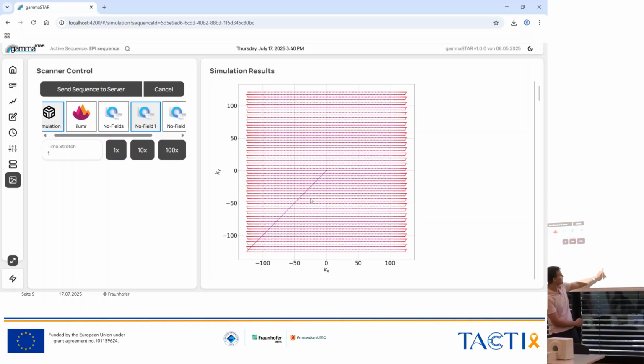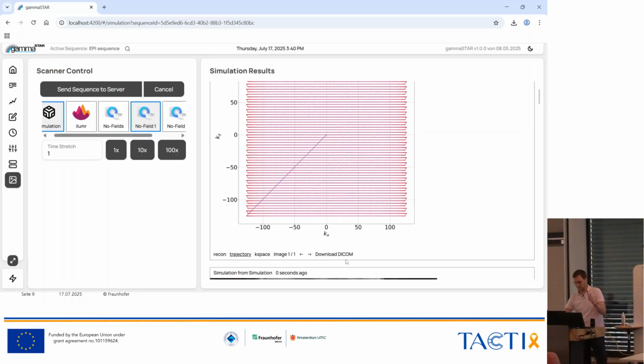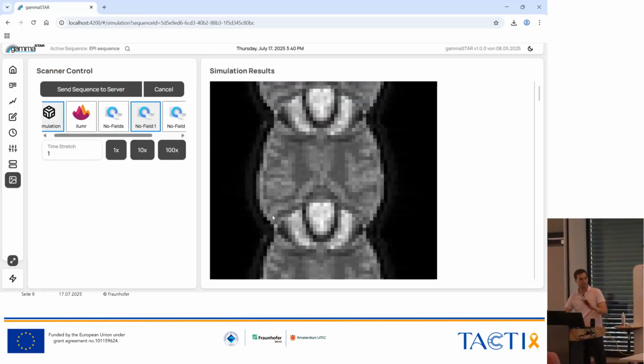This again here, this a bit to the right, and so on. So we introduce a frequency which is exactly changing each second line, which will then in spatial domain result in exactly one ghost perfectly aligned with half of the image, or half of the field of view.